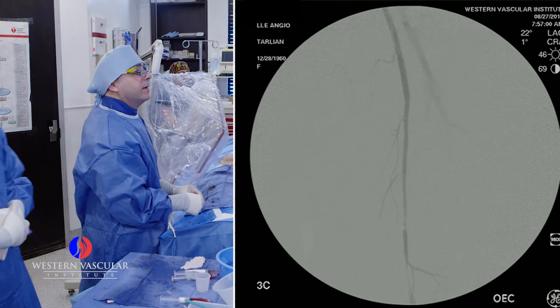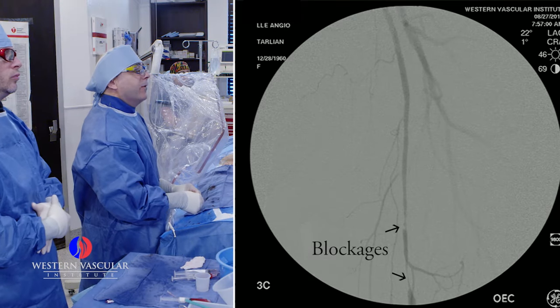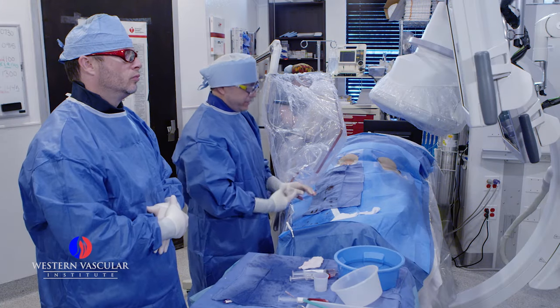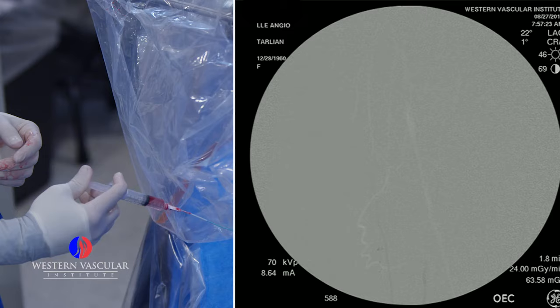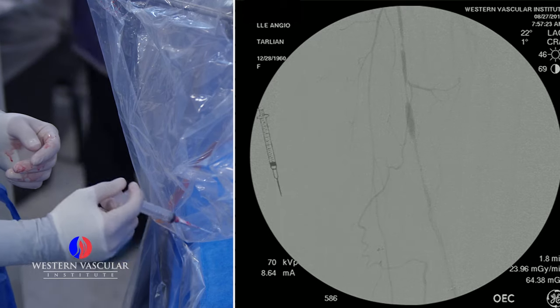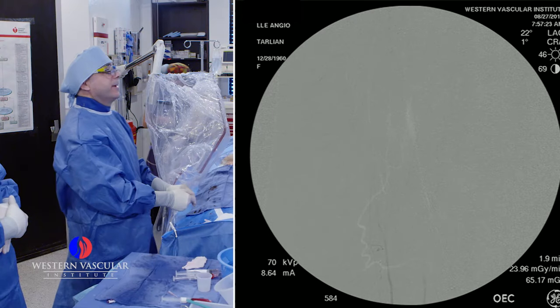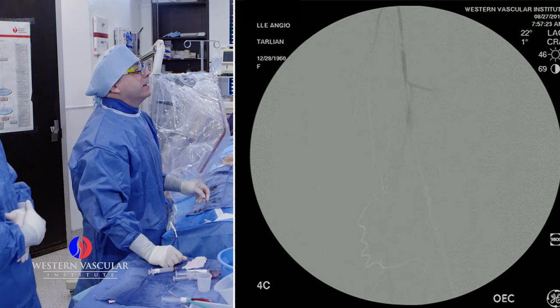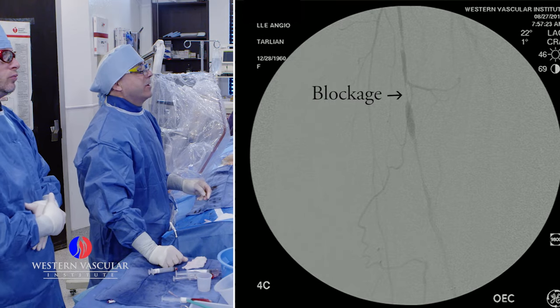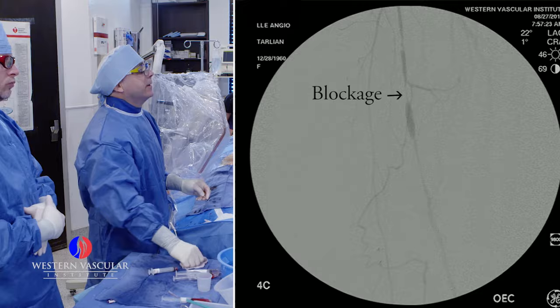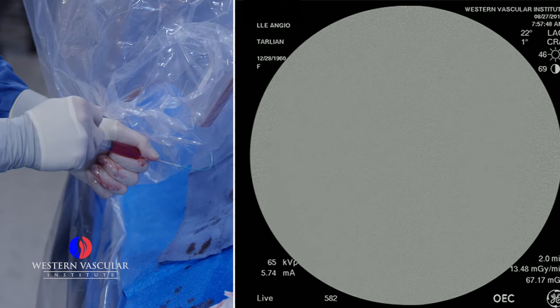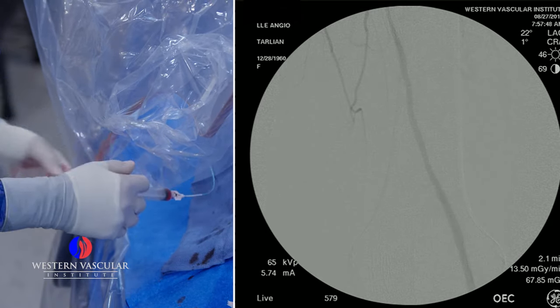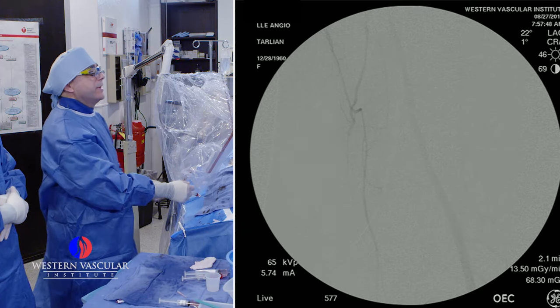You can see there's some re-narrowing inside the top of the stent. I'm going to head further south. You can see the flow through that area is quite sluggish. You can see the severe narrowing in the artery toward the top of the screen. And you can see the rest of the artery in the region of the knee — that looks pretty good.